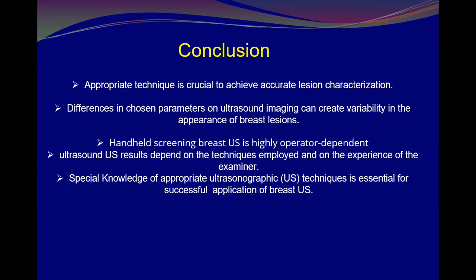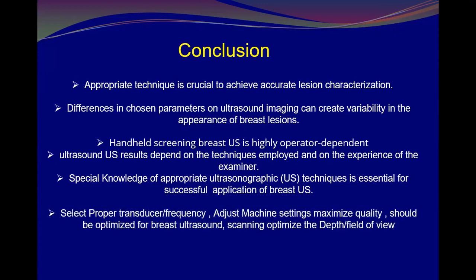We're talking about handheld ultrasound, which is highly operator dependent. So select the proper transducer frequency, adjust machine settings to maximize quality, optimized for breast ultrasound, and optimize the depth and field of view.